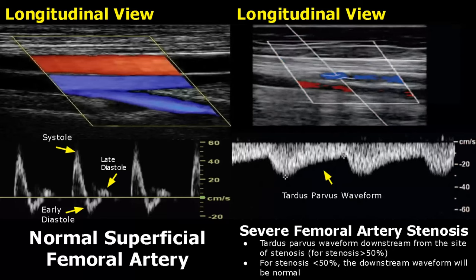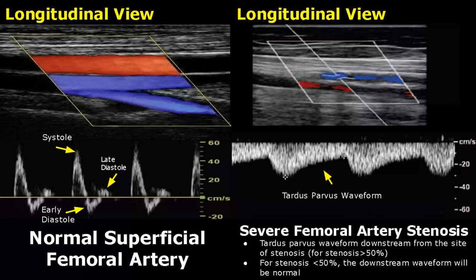A tardus-parvus waveform will be seen downstream from the site of stenosis for a narrowing of more than 50 percent of the lumen. A tardus-parvus waveform has a slow upstroke and rounding of the systolic peak — we see a blunt systolic peak. Downstream means flow after the stenosis, further down in the artery. For stenosis less than 50 percent, no tardus-parvus waveform will be seen downstream; that waveform will be normal.